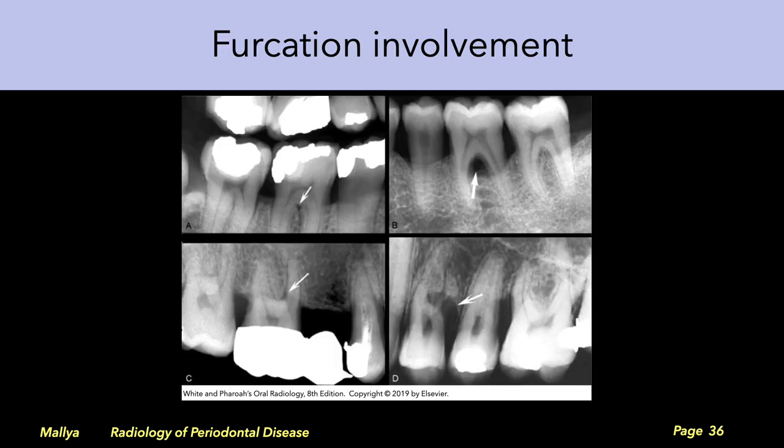Next, evaluate the region of the furcation. For each multi-rooted tooth, trace the periodontal ligament space along the root to the area of the furcation. Determine the level of bone in the region of the furcation.